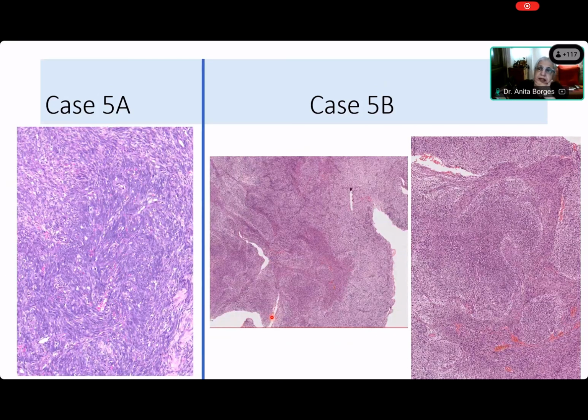Now tell me, are these spindle cells? Yes, ma'am. Very good. Pattern? In 5A, they are arranged in fascicles. Yes. Okay. Ma'am, herringbone pattern. In a herringbone pattern? No, I don't think so. I just think that they're in fascicles. No, in a herringbone pattern, and if you think this is a herringbone pattern where you see a spine there, okay, that's not a spine. No, in a herringbone pattern, the two ribs meet. They actually have to meet. Let me see if I can. Right.